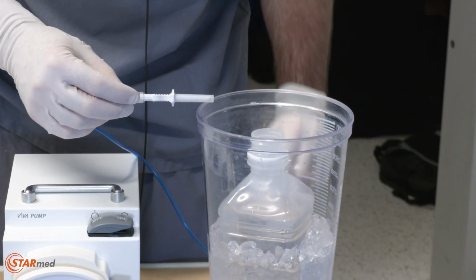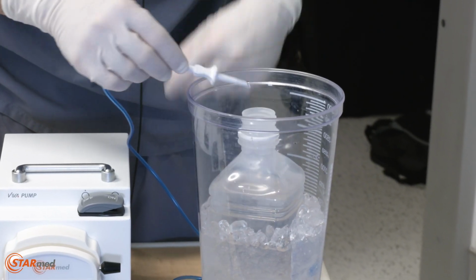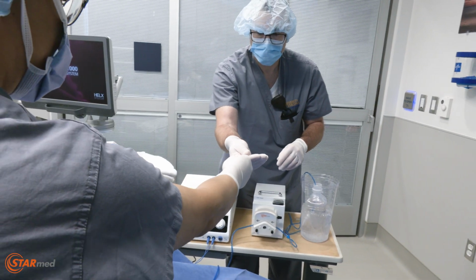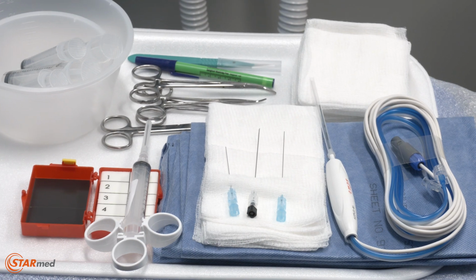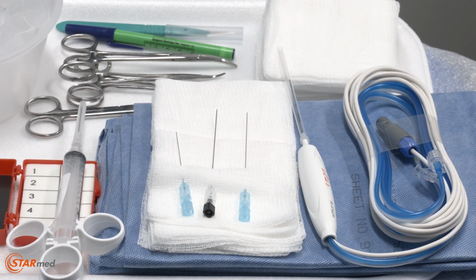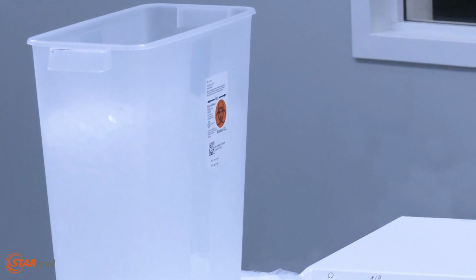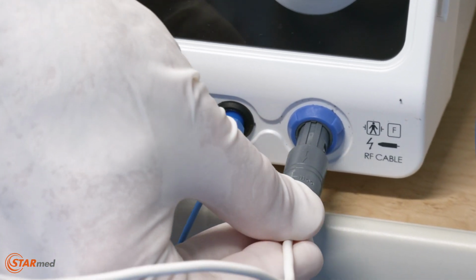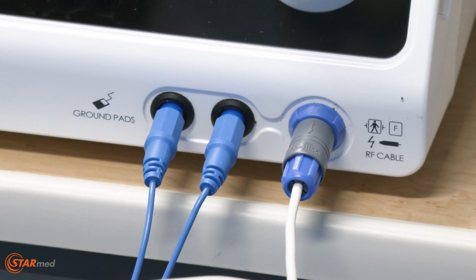You are now ready to insert the inflow tubing's connector into the saline container. Remember, the clear tube is for the outflow. One end connects to the electrode, while the other end goes into a container for collection. The last connection step is to plug the electrode's cable into the generator.